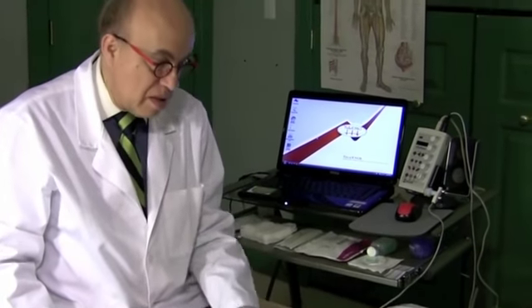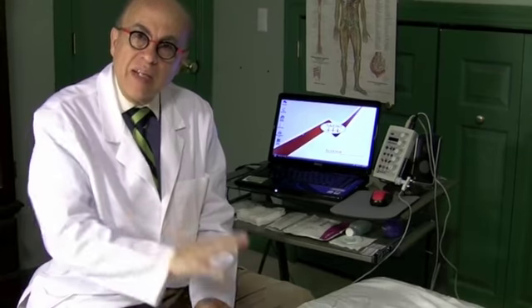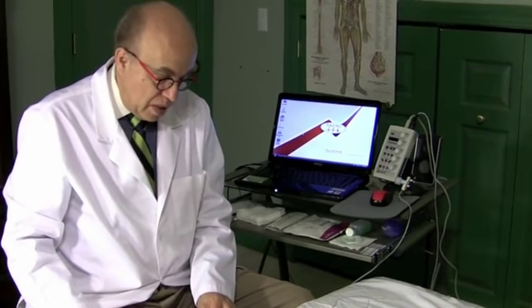But sometimes you need to do further studies and you need to explore other muscles that you have not studied with the nerve conductions, so you need to do a needle exam. Let's start with the needles that we use. Right away I will tell you there are different types of needle electrodes. Some are called concentric, which really means there is a shaft, there's a cover, and there's a wire inside the shaft. So it has really two electrodes inside that needle, essentially.